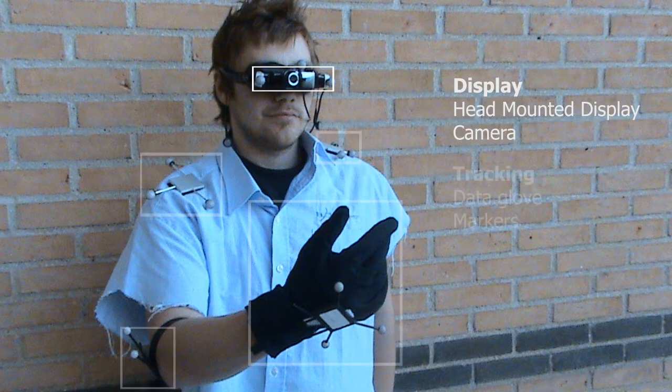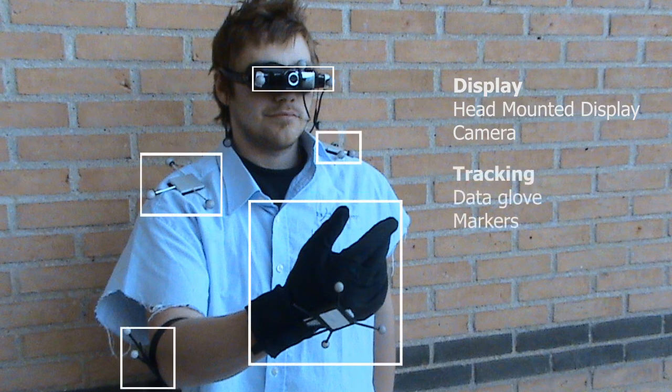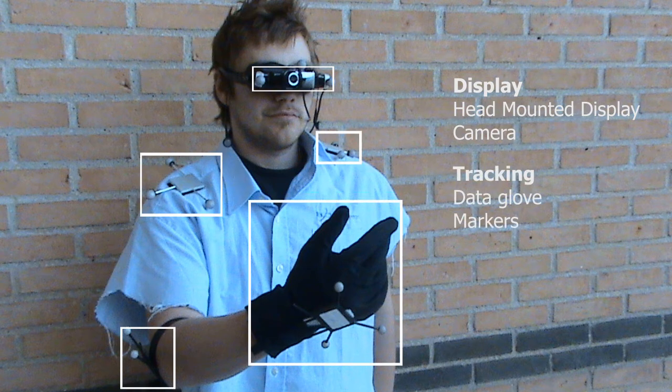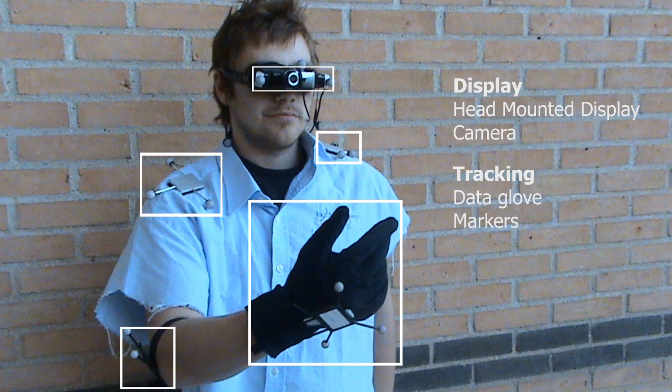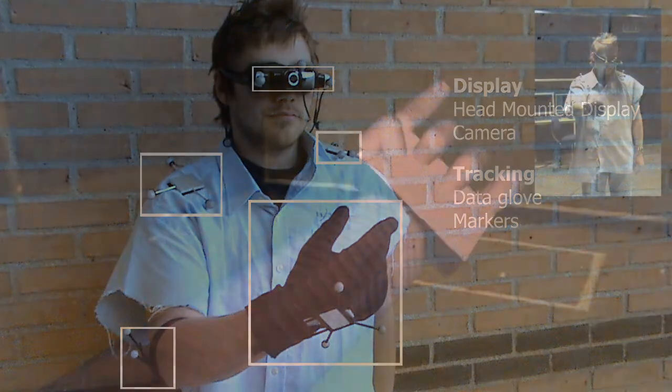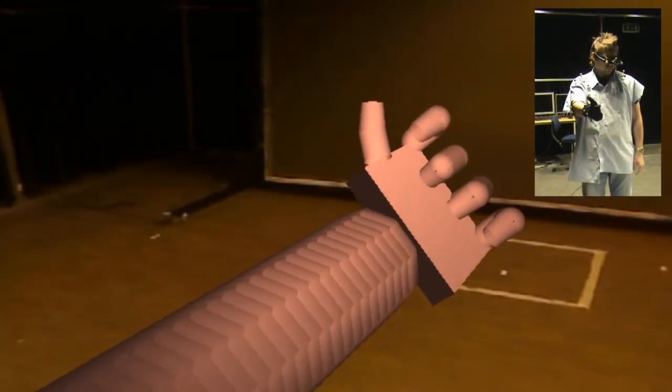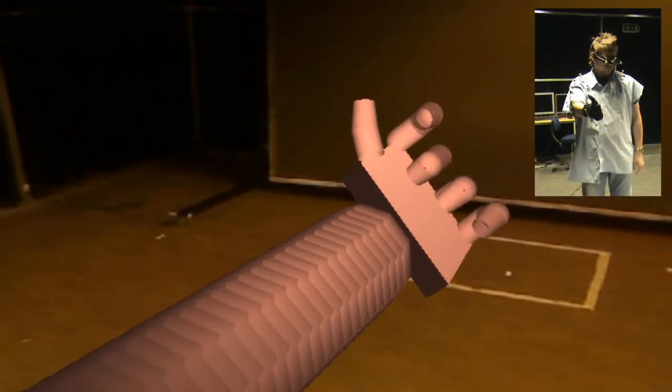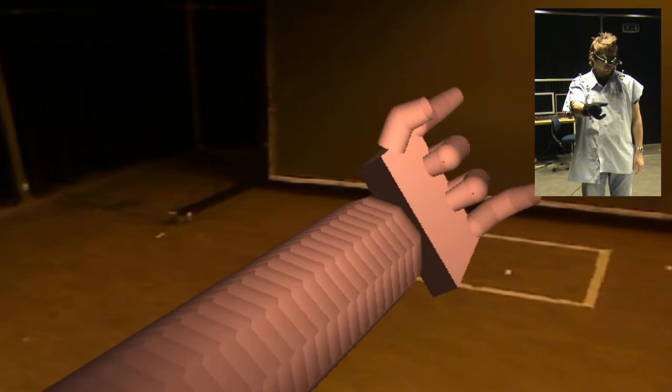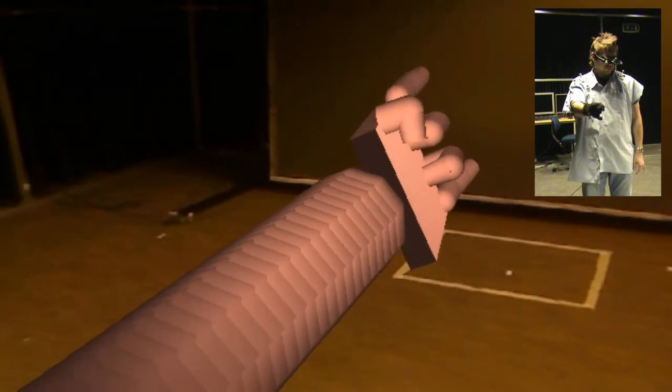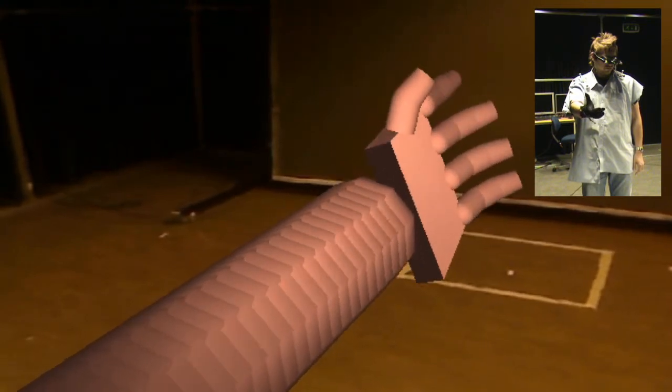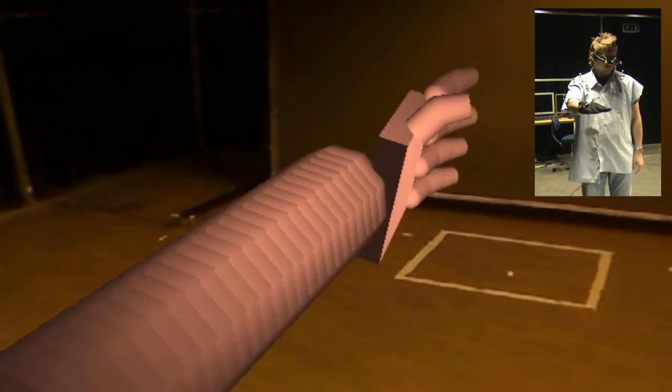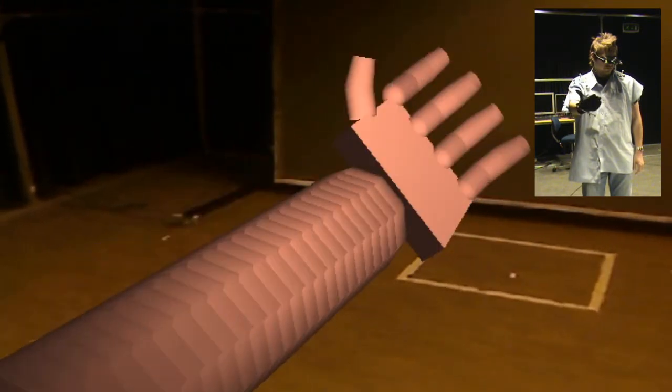The augmented reality is based on data from a data glove and an optical tracking system tracking the markers placed on the subject. A virtual left arm mirroring the movements of the right arm is inserted in place of the normal arm.